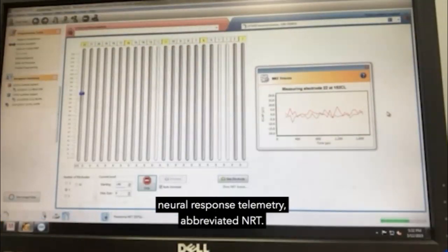Okay, so she said electronically or electrically evoked. It was wrong in the subtitle. It should be evoked, EVOKED. Okay, and so what they're doing is essentially making the electrodes evoke an auditory potential, the compound action potential we call it, which is essentially like the ABR. So think of compound action potential as very similar to like wave 1 of the ABR response. If you remember, there's 5 waves that we look at.